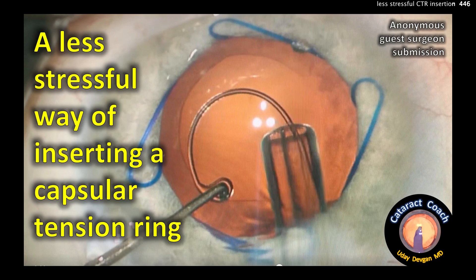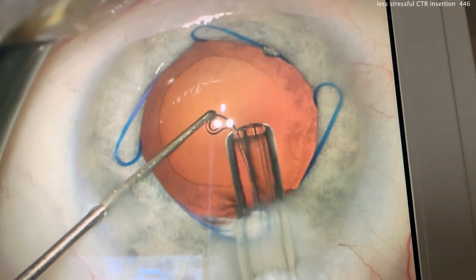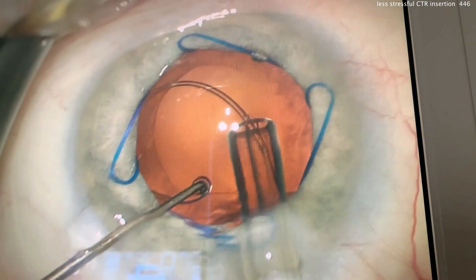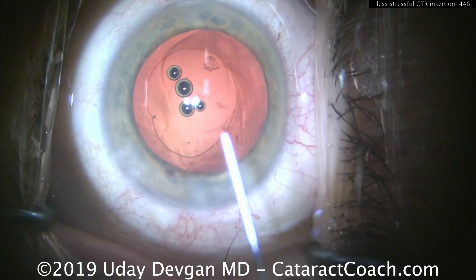CataractCoach.com presents a less stressful way of inserting a capsular tension ring. Watch carefully: using a Sinski hook, the leading eyelet is held in position while the CTR is advanced. A lot of it can be put inside the eye without putting stress on the zonules. At the end, simply release.